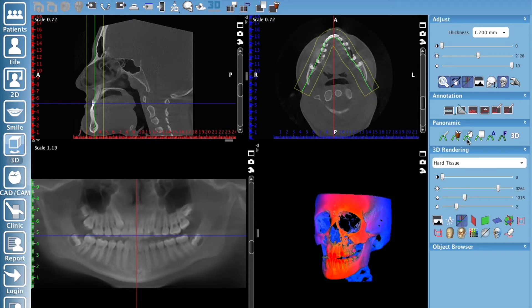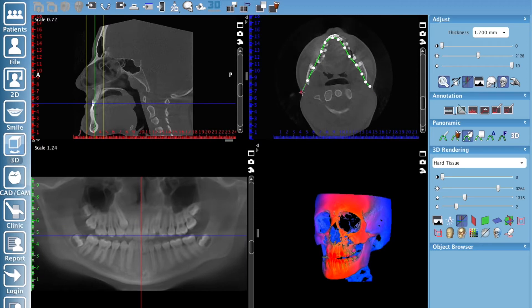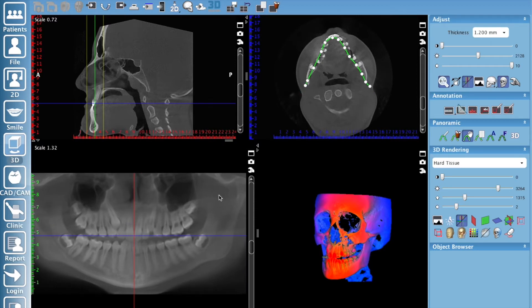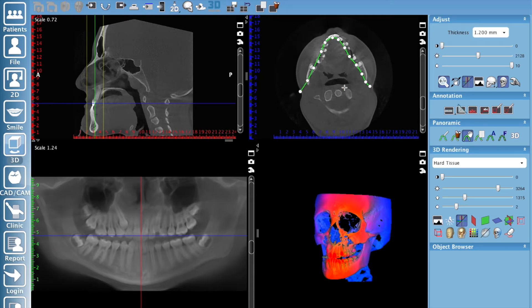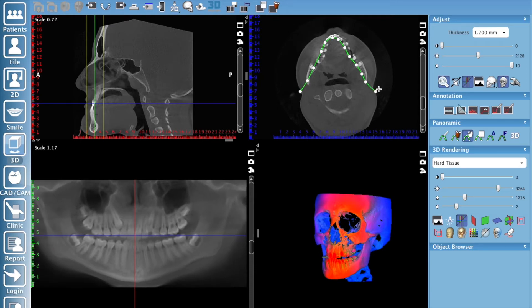You can always hit your edit points and move things around and adjust them. Especially if the software draws a curve that's a little short and you don't see your condyles — you can grab the end point and create the image a little bit larger there as well. So that's one way you can create your panoramic curve.